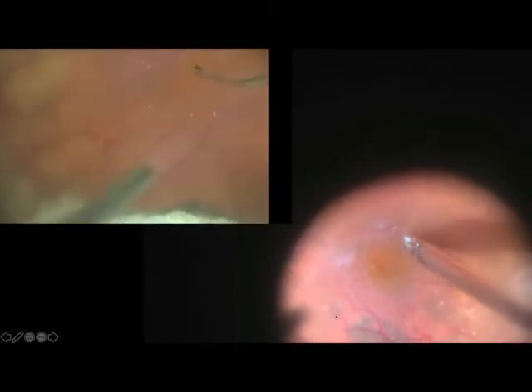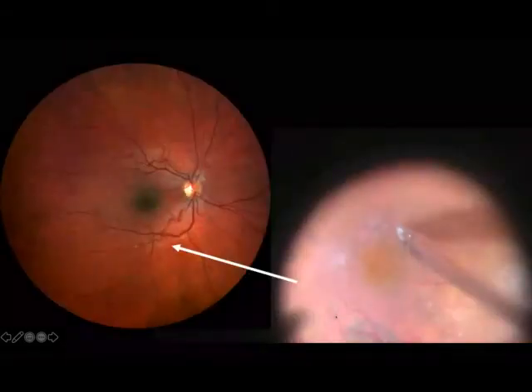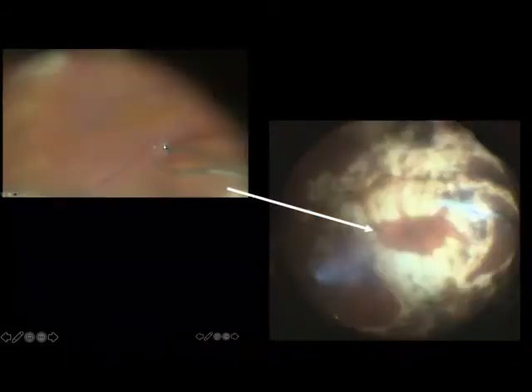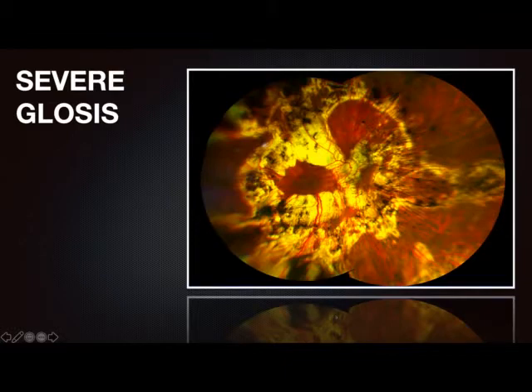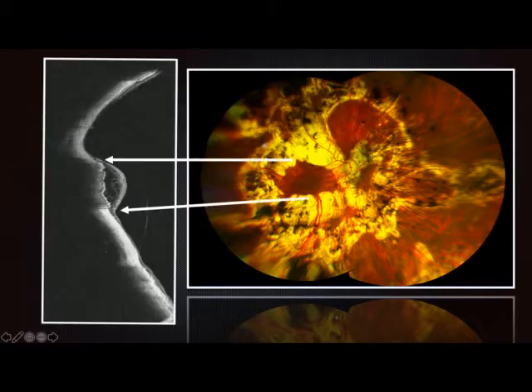These two peelings seem the same. We are peeling an epiretinal membrane at the posterior pole in two different eyes, but you will see that the one on the right is in this type of fundus. The one on the left is in this type of fundus, which is totally different, as you can imagine. This is a man who can see only through that central island of choroid.